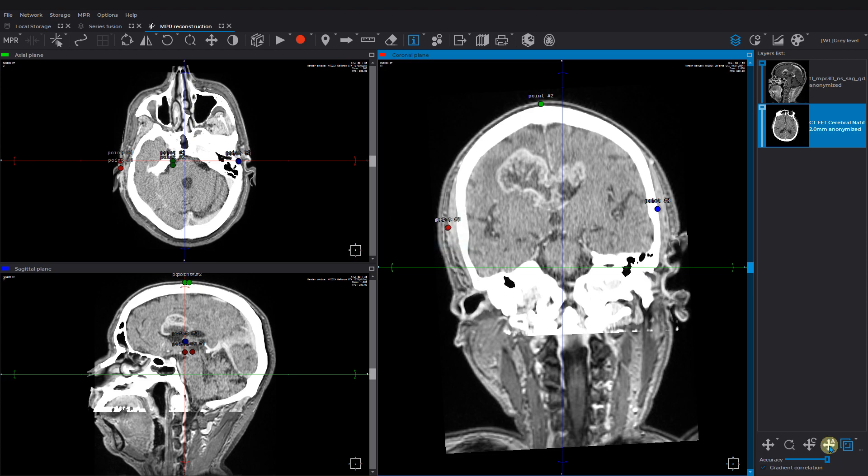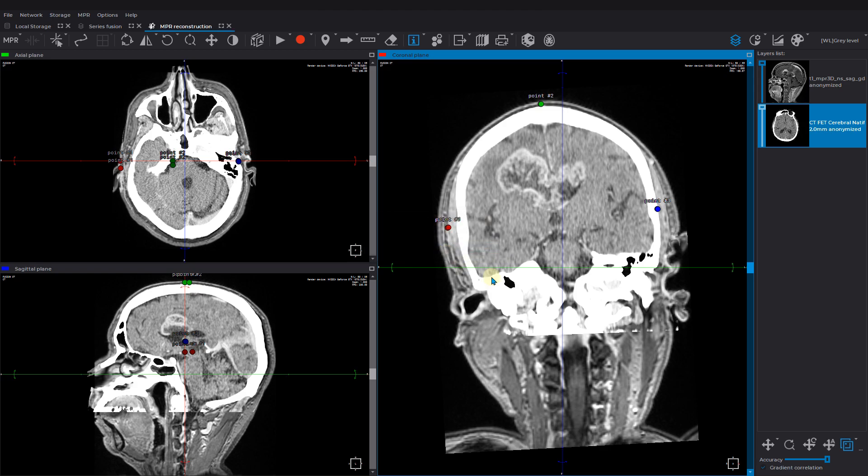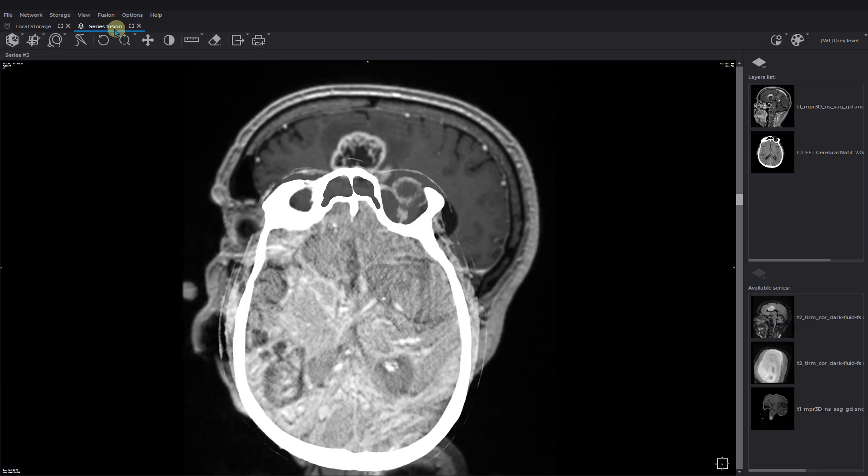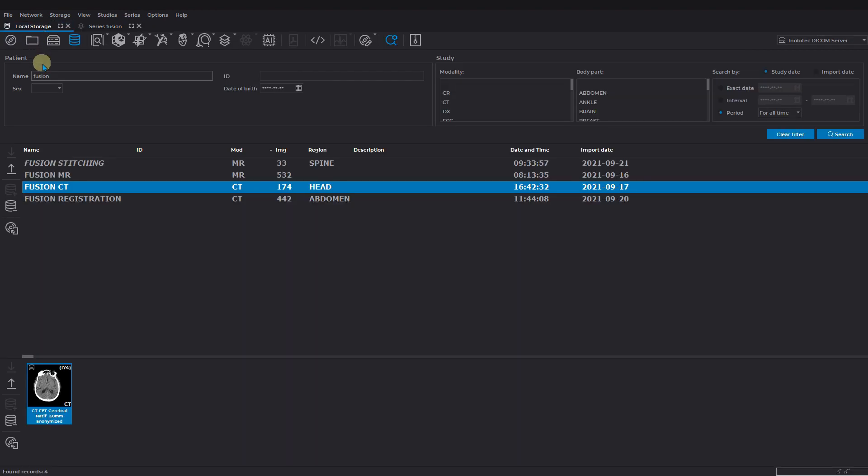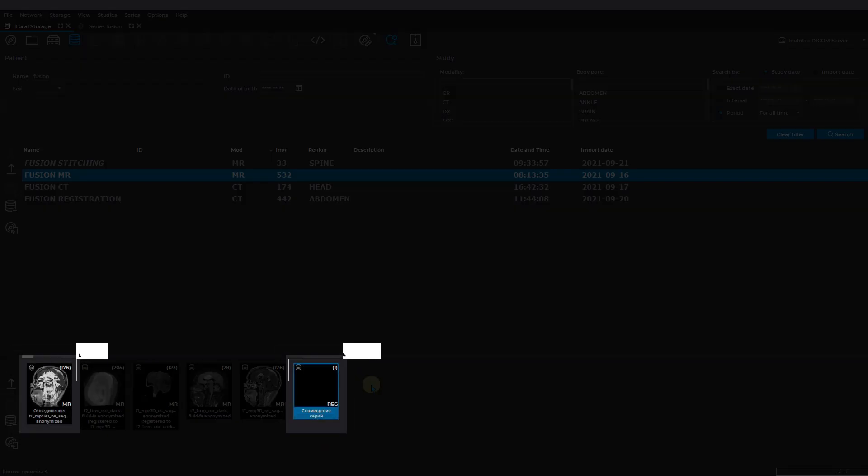If you want to save the result at any stage for later work, you can export the current series transformation data to the DICOM object. Just click on this tool icon and add the description. The results are saved to the local storage as new series. As you can see, the fused series is saved to the same location as well. It is marked with the special icon.